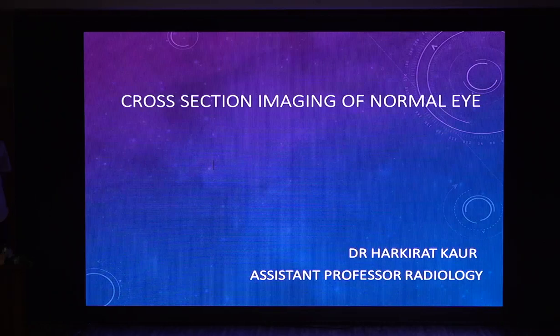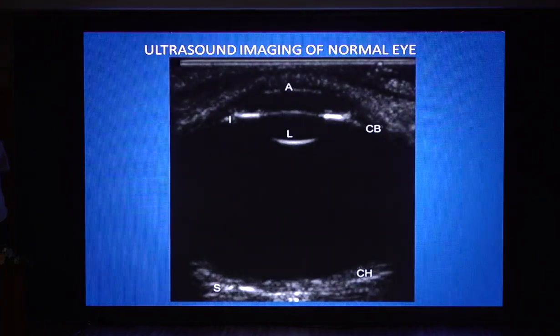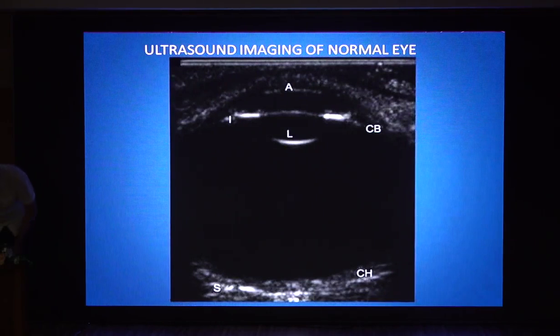Good morning, everyone. Today, the topic of my lecture is cross-sectional imaging of the normal eye. So, first of all, we will begin with the ultrasound imaging of the normal eye. So, beginning from anterior to posterior.